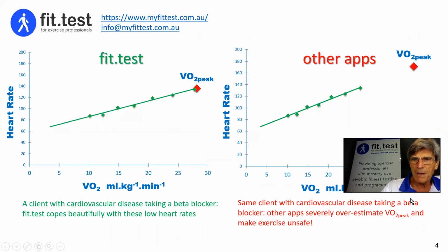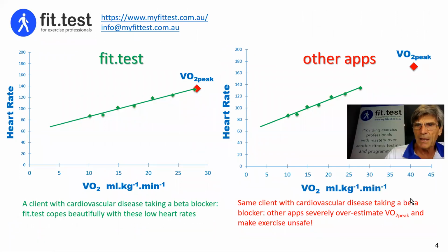Now, I want to come to the main topic of this video. What we have here is slightly hypothetical, but it'll make the point really beautifully. The first example is how I use fittest for clients with low exercise heart rates.